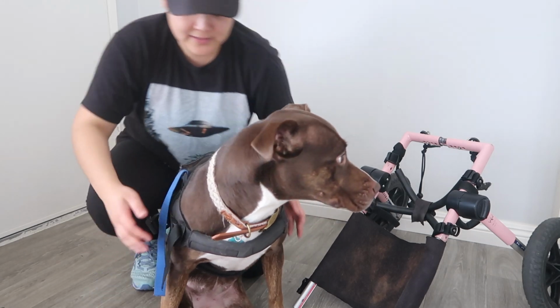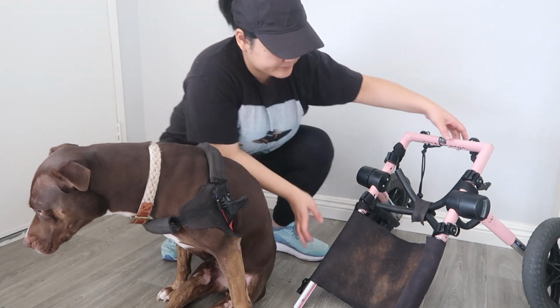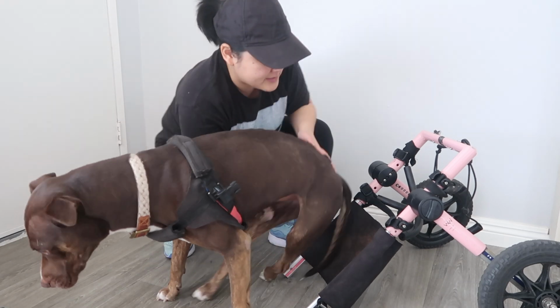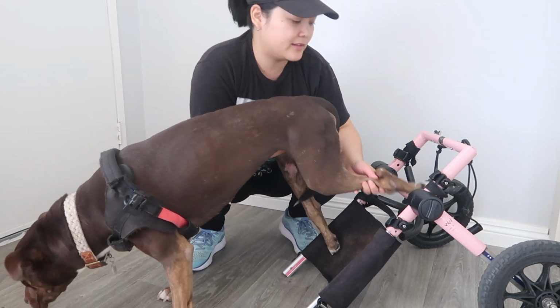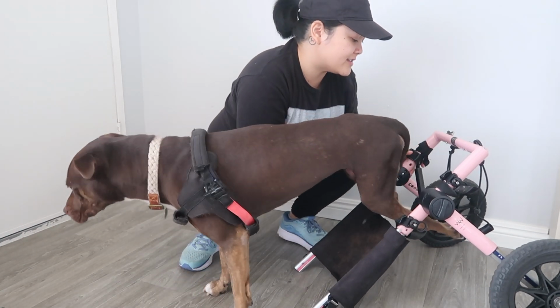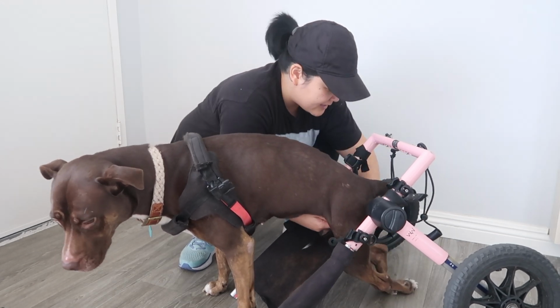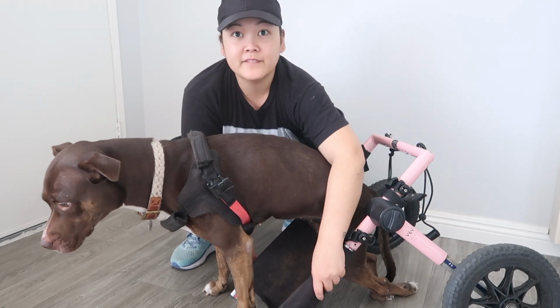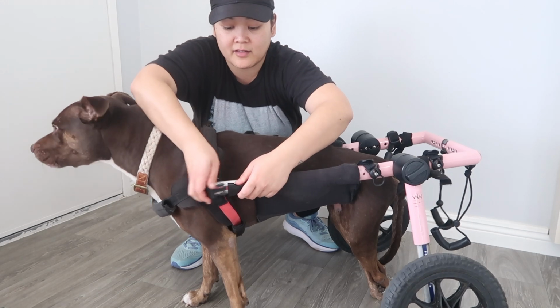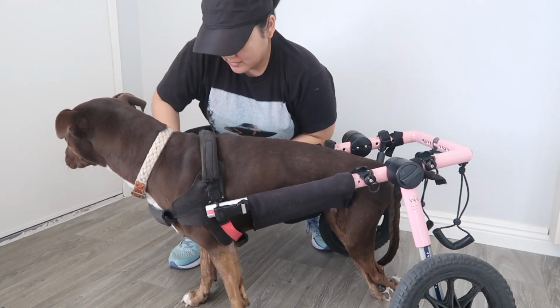So now what I do is I make her turn this way. Face this way, baby. Make her wheelchair go right behind her. And then I lift her belly up. And then I stick one leg in and the other leg in that little X in the back. And then I roll her wheelchair forward. Make sure her knees are good. Her tail is out. And then you lift this. Buckle right there. Do another buckle right here.